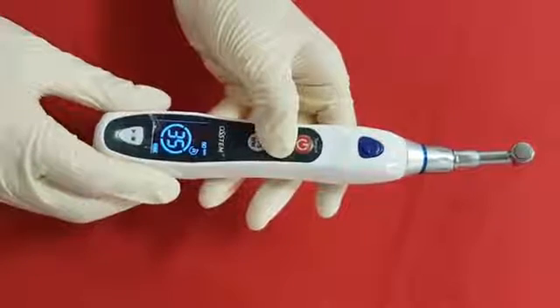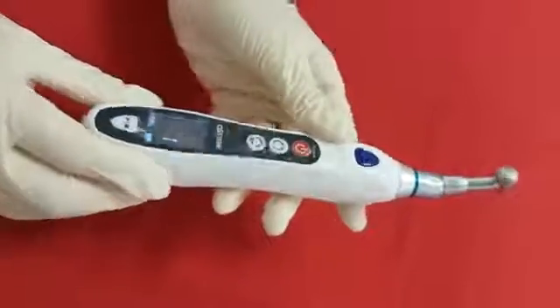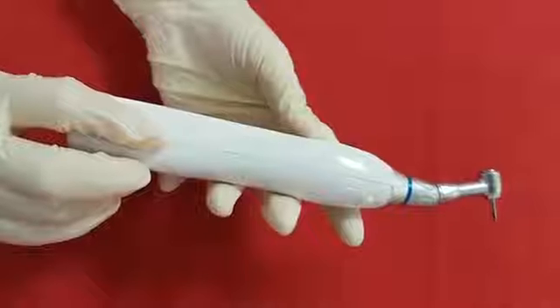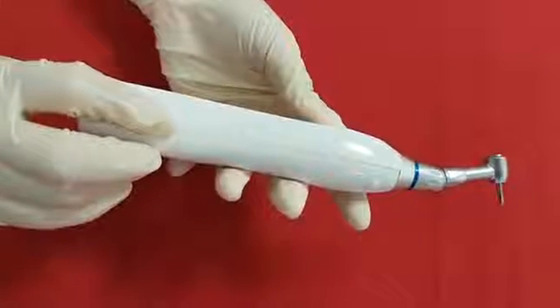And this button has another function, which is auto-calibration. Calibration performs when this button is pressed longer than 2 seconds. In 3 seconds, calibration will be completed.